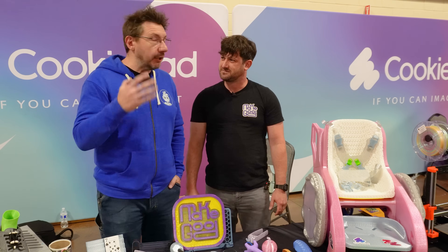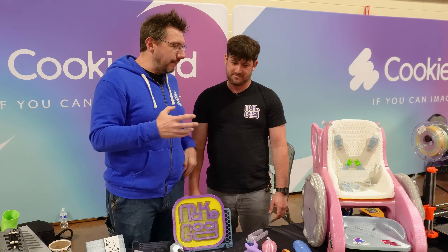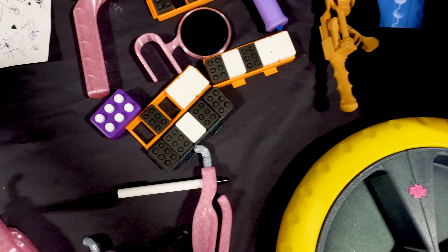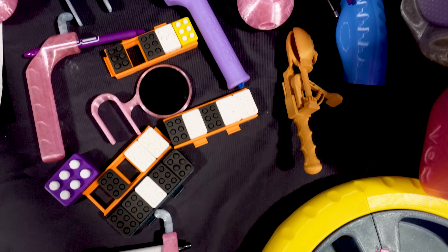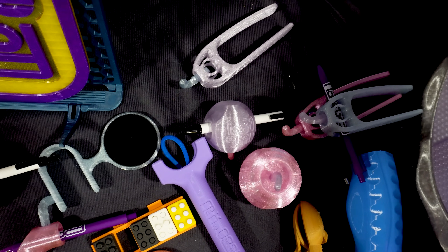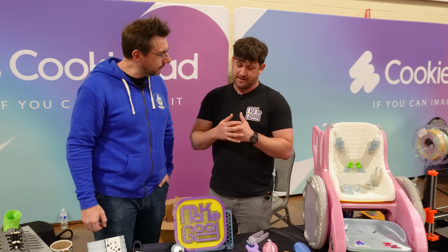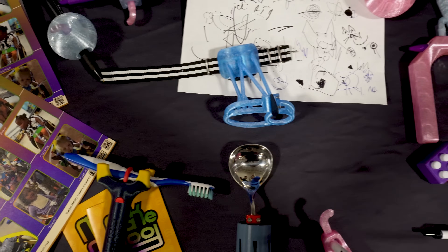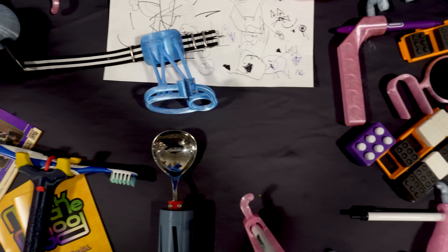This summer there's going to be a lot of people who want to find out more about this, and also about Make Good. Because if we look on the table here, you're not just making a mobility trainer — there are a lot of assistive devices here. We design and print all manner of assistive technology, and this is really just a very small example of our repertoire.